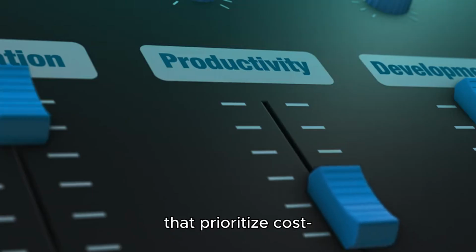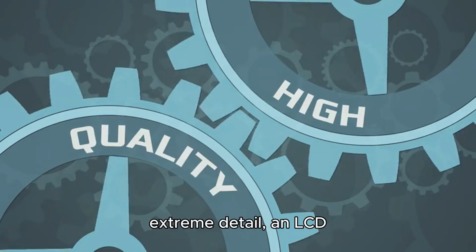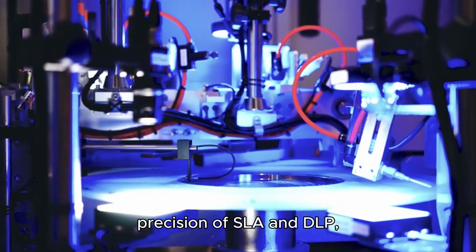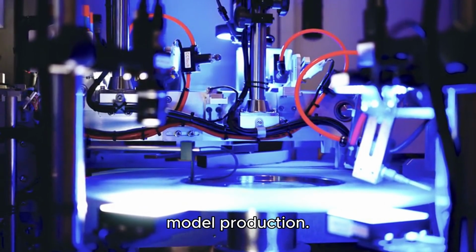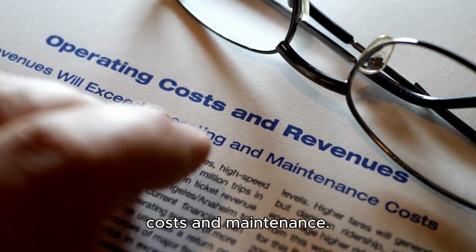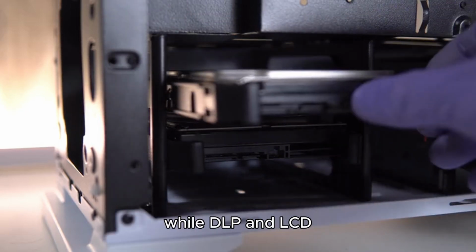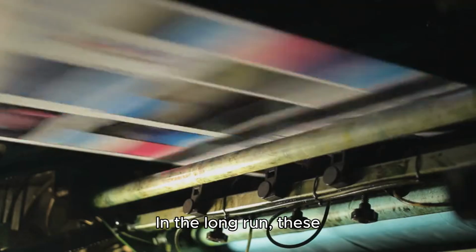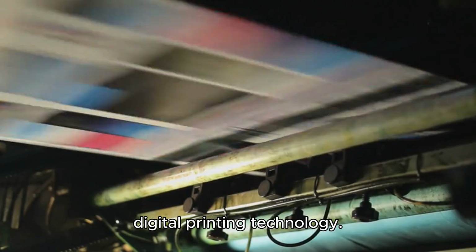Finally, for practices that prioritize cost-effectiveness or need a high production volume without extreme detail, an LCD printer is a solid option. While it may lack the precision of SLA and DLP, it's reliable and budget-friendly for general model production. It's also essential to consider ongoing costs and maintenance. SLA printers, for instance, require regular calibration, while DLP and LCD printers generally have lower maintenance demands. In the long run, these factors can impact your total investment in digital printing technology.